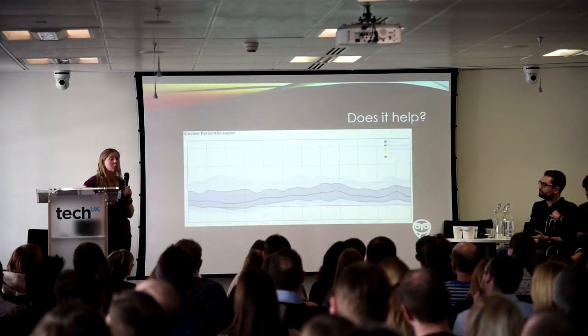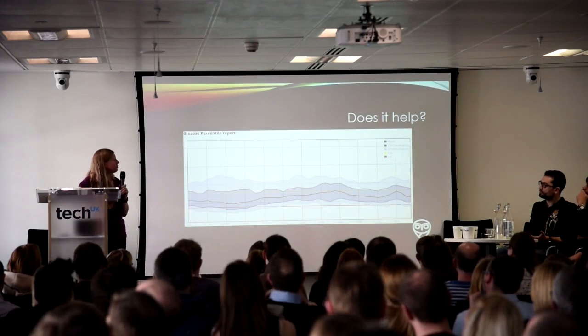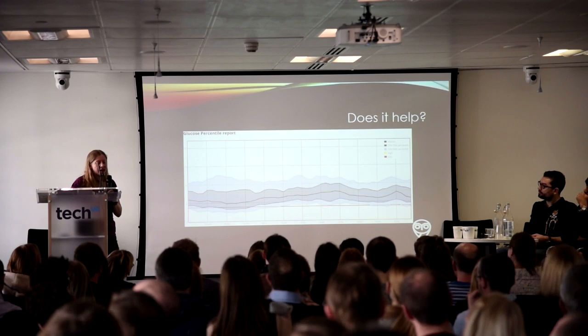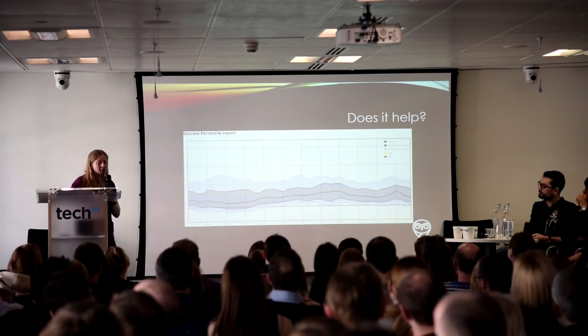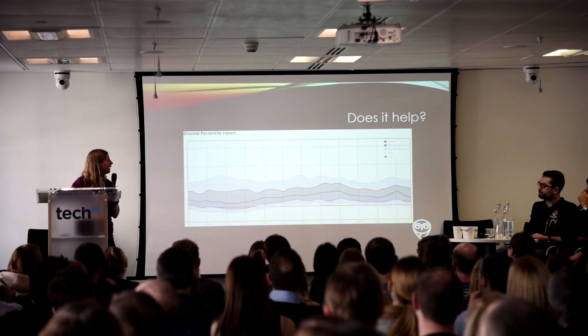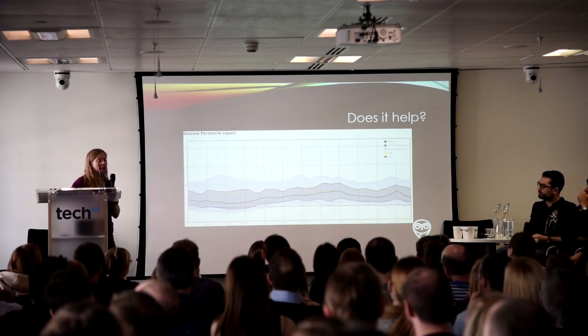So does it work? Does it help? So this is 3 months before I started looping. It looks pretty good. HbA1c was 6%, my average blood glucose was 6.9, and I had a standard deviation of 3.2. And then I started looping. It was a stressful few months.